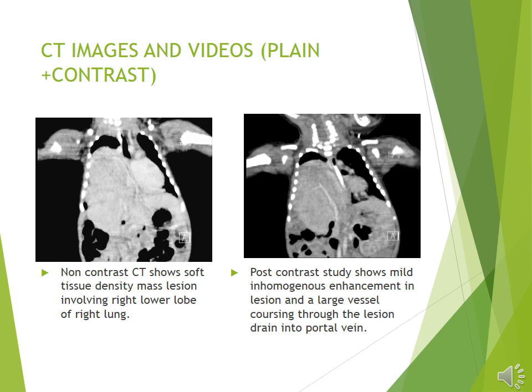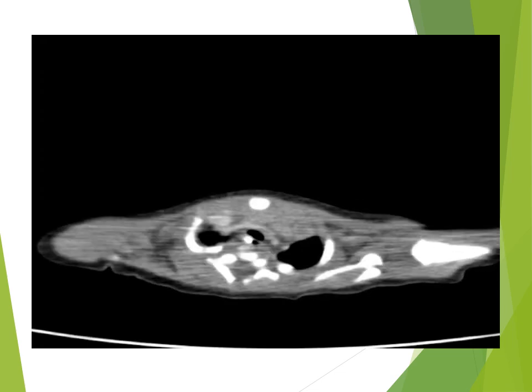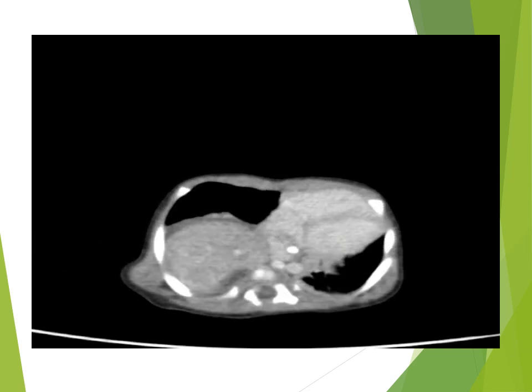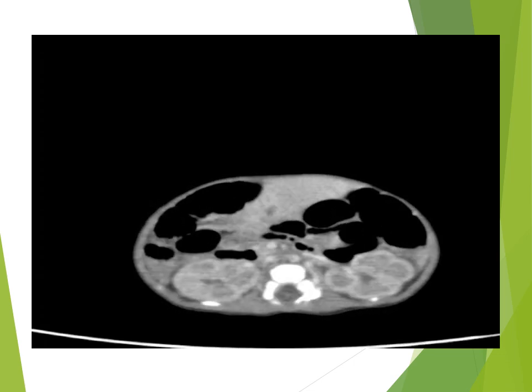Non-contrast CT shows soft tissue density mass lesion involving the right lower lobe of the right lung. On post-contrast CT study, there is mild inhomogeneous enhancement in the lesion and a large vessel is seen coursing through the lesion, draining into the portal vein. A dilated hemiazygous vein is also seen.